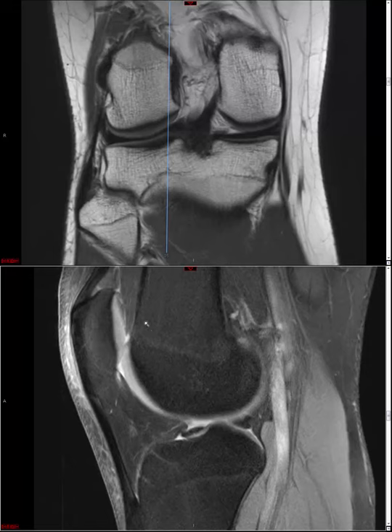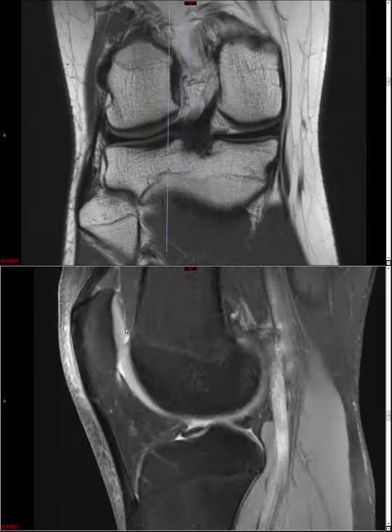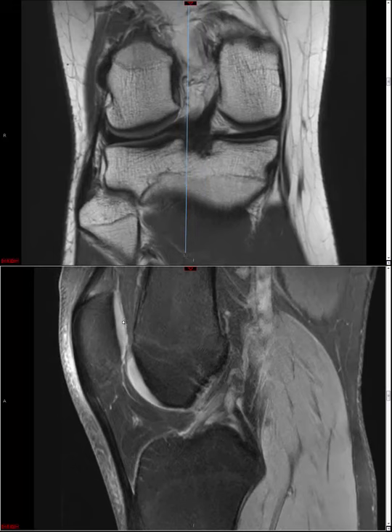When we start seeing thinning, then that corresponds to defects that they can actually see at arthroscopy. And if it's less than 50% of the thickness, then generally I would call that moderate, but you might call that grade 2, okay, if you're someone who likes to grade. If it's more than 50%, then I still call it moderate, you might call it grade 3. And I only call it severe or grade 4 if I see evidence that the cartilage is full thickness.